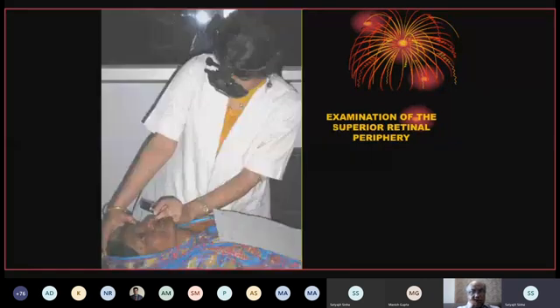Now see, when you see the superior periphery, the patient looks up, you are holding the lens tilted a little up so that you avoid deflections, and I am moving backward like a Bharatnatyam dancer. I'm going forwards, backwards to get a good view. So that is one more reason why there should be space behind your table so that you can move all around the patient. Okay.